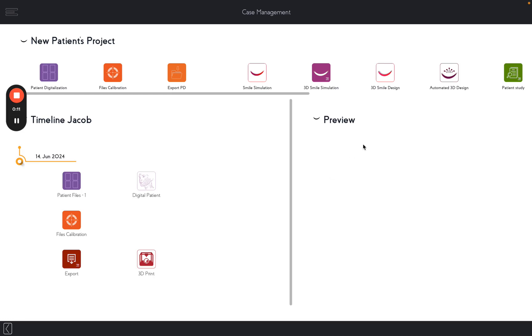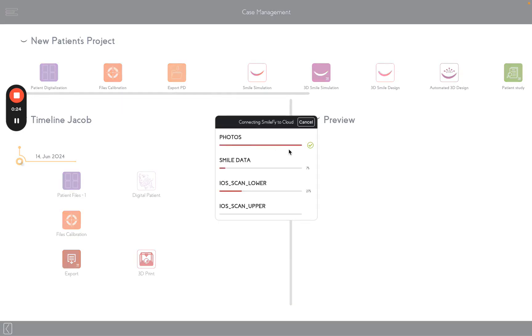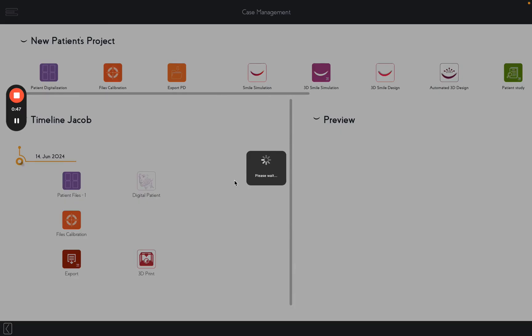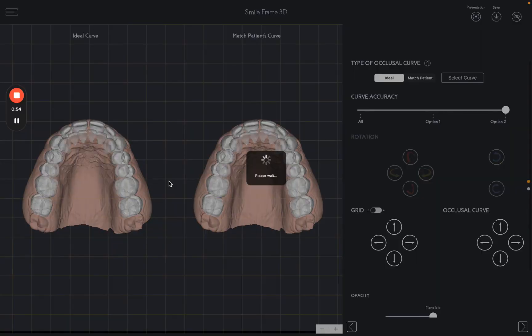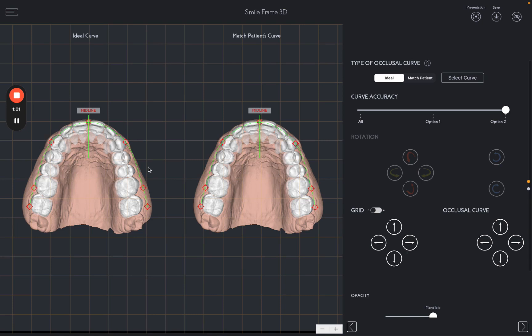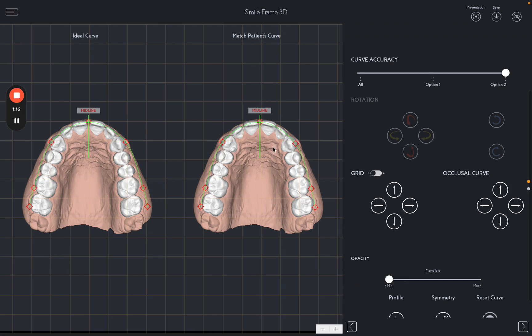Let's start by selecting the workflow: Automated 3D Design. The AI automatically sets the occlusal curve based on the position of the current teeth. Select between Ideal Curve, to ensure symmetry on both sides of the patient's arch, or Match the Patient's Curve, to preserve the existing occlusal curve of the patient's arch.